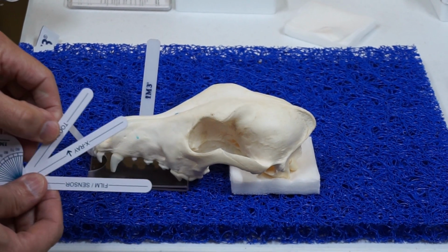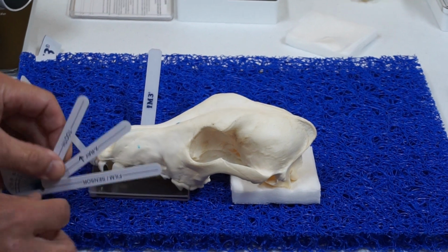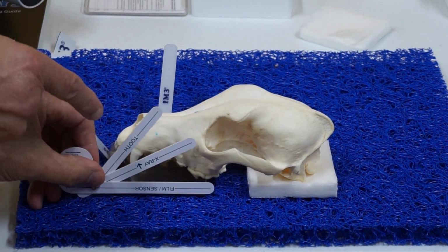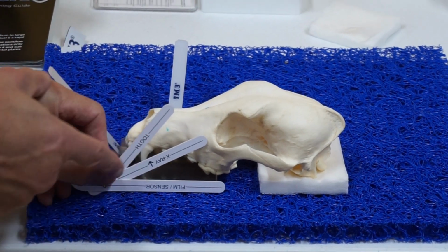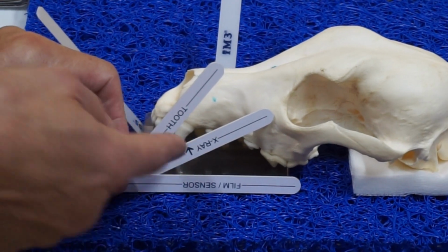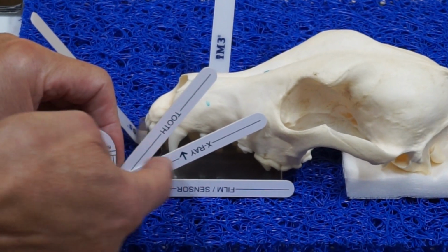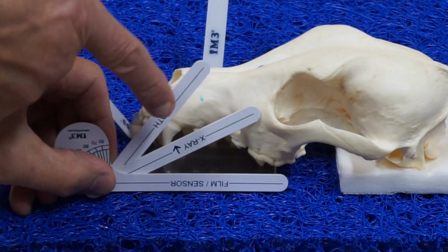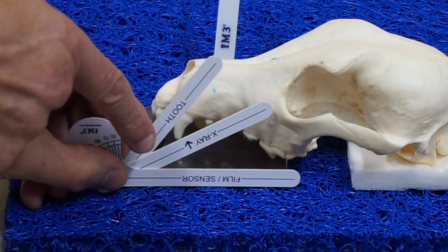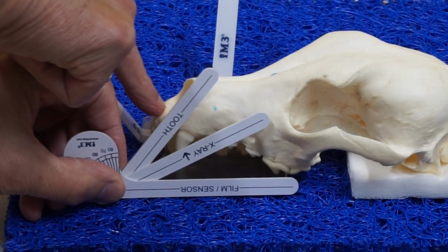So if we've got the long axis of the tooth and the long axis of the film, and we shoot at right angles to the bisecting angle, which is, this is two equilateral triangles here, so this is the bisected angle here, and it forms two equilateral triangles. We shoot at right angles to that bisected angle, that's the bisected angle. You'll get a one-to-one image of the tooth on the film.